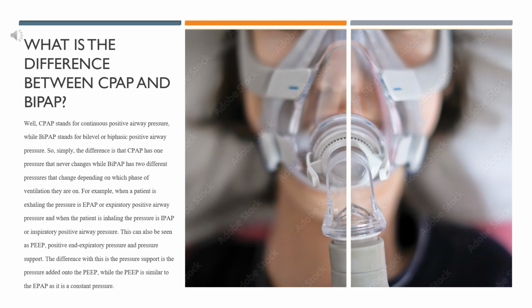For example, when a patient is exhaling, the pressure is EPAP, or expiratory positive airway pressure, and when the patient is inhaling, the pressure is IPAP, or inspiratory positive airway pressure. This can also be seen as PEEP, positive end expiratory pressure, and pressure support.